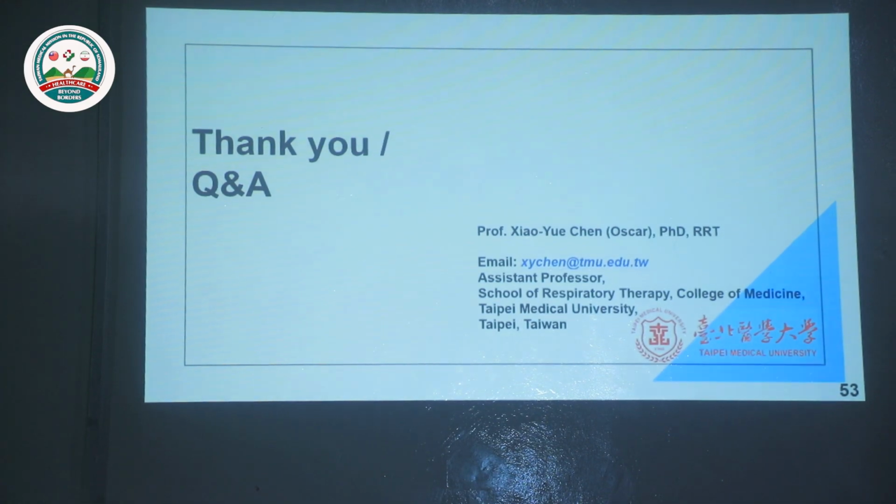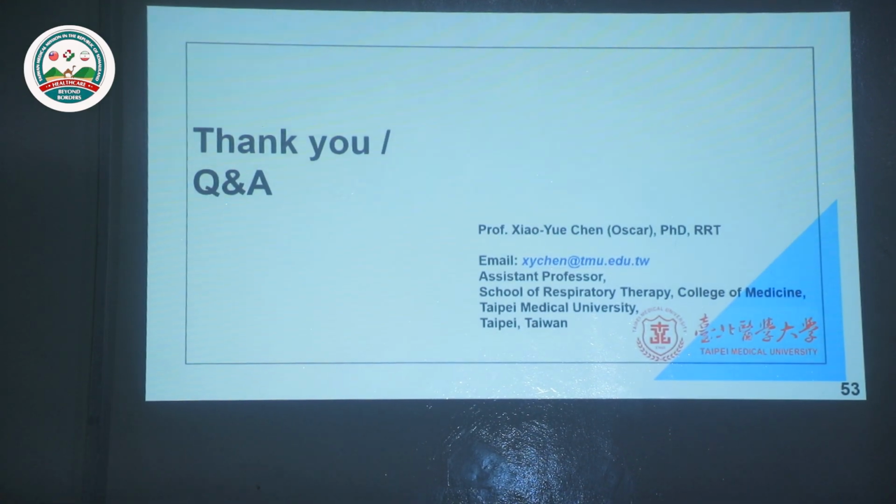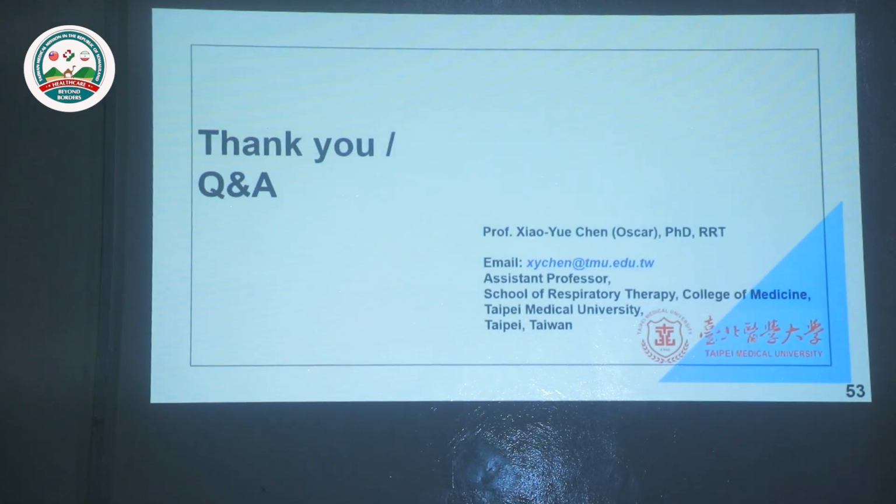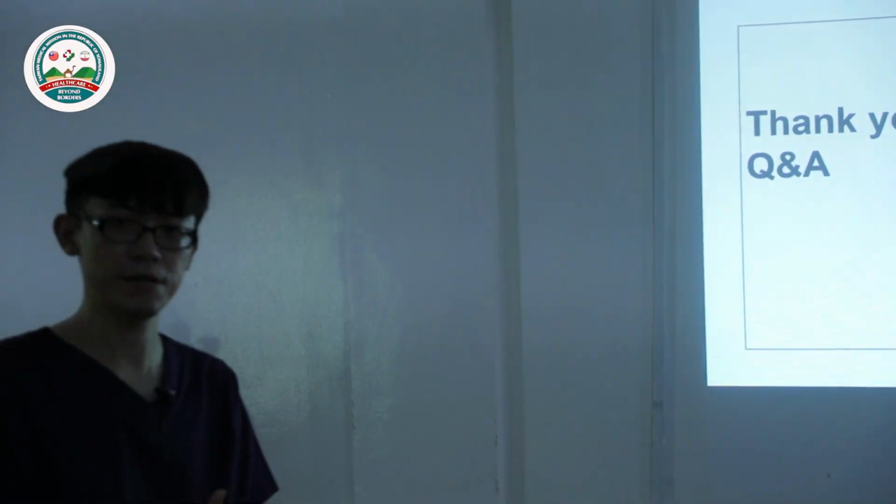So this is all a brief introduction about the ventilator settings and how to use the modes, and finally how to disconnect the ventilator and turn off the ventilator. Thank you.